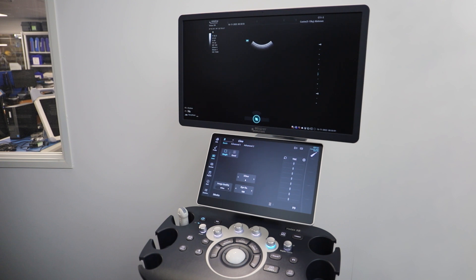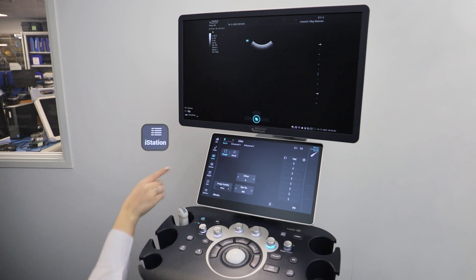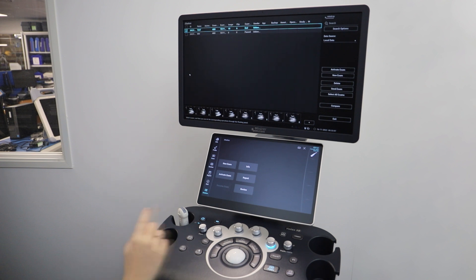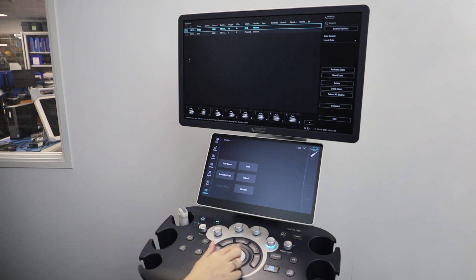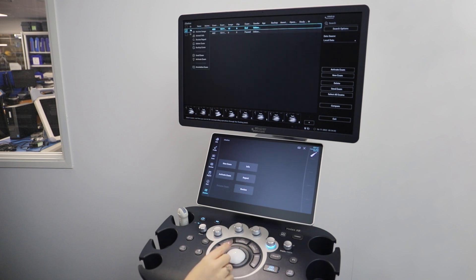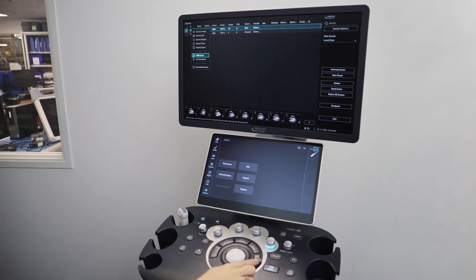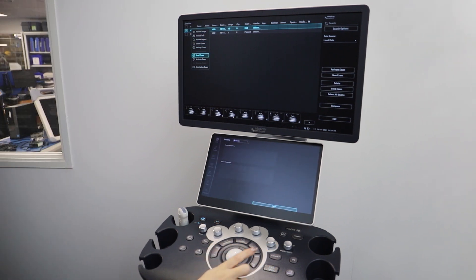To export the images you will need to click on iStation again. Here you can select the patient files you wish to export, or click on select all. If you then select the send exam from the menu, you'll be able to export your exam to a USB stick or external hard drive.